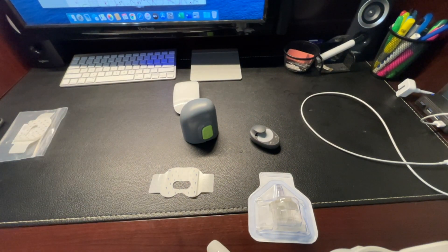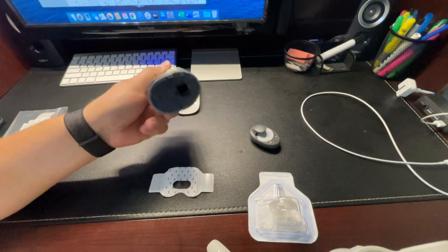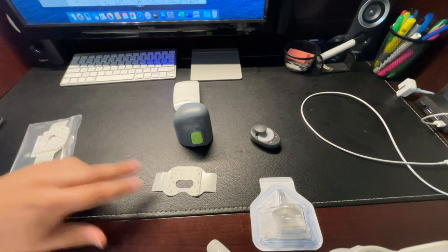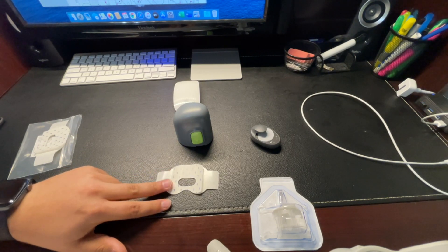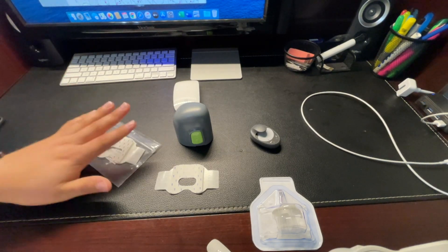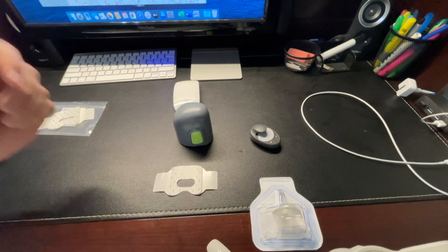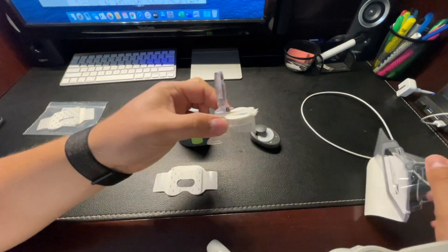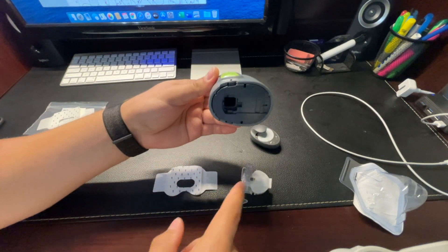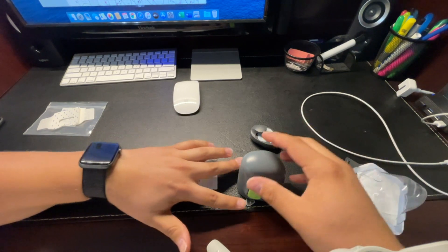Just in case you're thinking about switching to Medtronic and want to know what's included in a sensor change — here is our Serter. This is the charger for the transmitter, one sensor, and your Medtronic oval tape. Medtronic provides enough oval tape for two pieces per sensor. So in a box of five sensors, there's an envelope with 10 pieces of tape. I personally only use one. It's very easy to open up the sensor, lay it down on a flat surface. There is a hole in the Serter — that's where this long piece goes. It eases down on there and clicks so you know the sensor is locked in place.